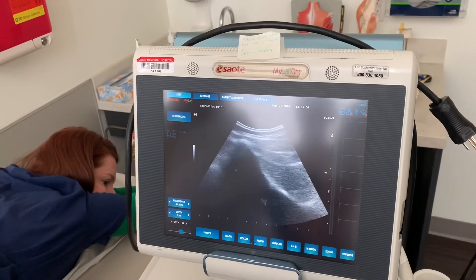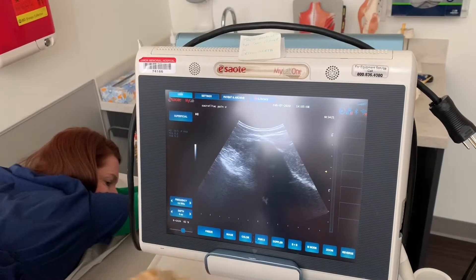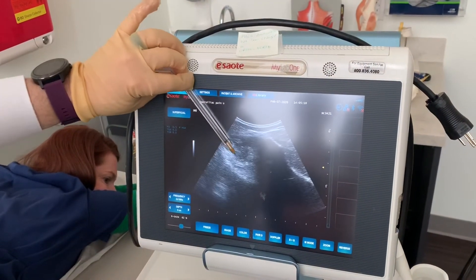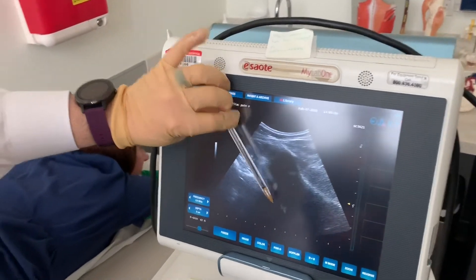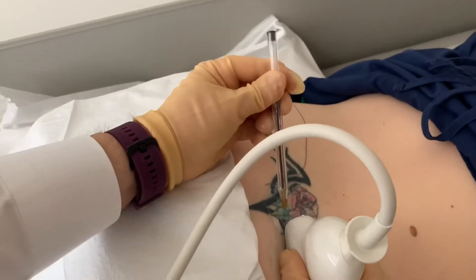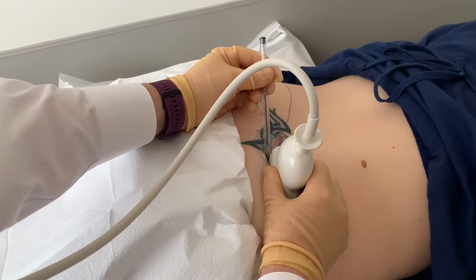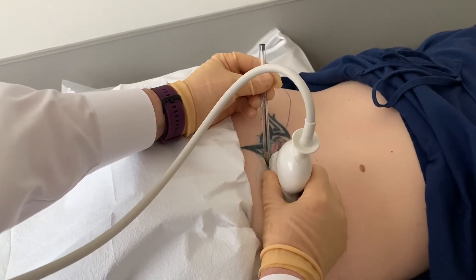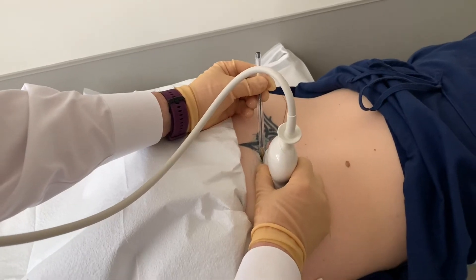Here's the ilium all the way out. We go medial, following that bone until we get inside. We go medial to lateral at about 45 degrees of inclination, watching with the ultrasound. You go until you hit the bone, and that means you're in the joint.